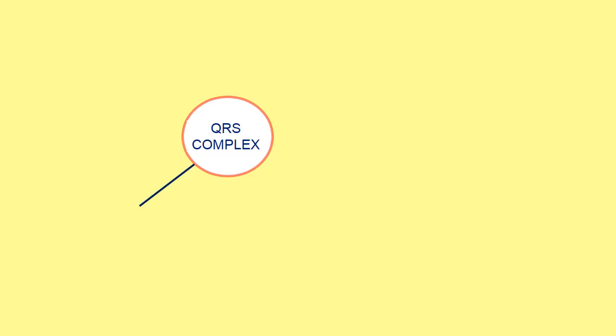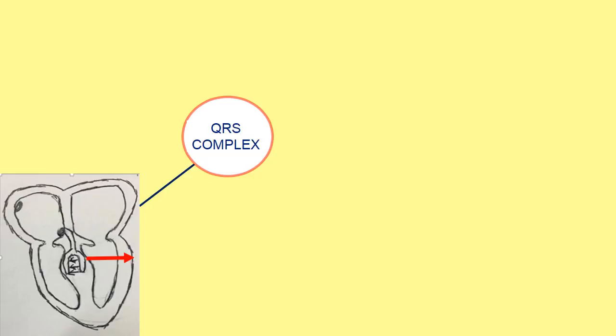Okay, QRS complex. We talked about the shape of the QRS waves in the right ventricular leads and left ventricular leads. We mentioned that the septum is the first to be depolarized, and the septum is depolarized from left to right, and that in a normal heart, the left ventricle is the one that influences the ECG the most.